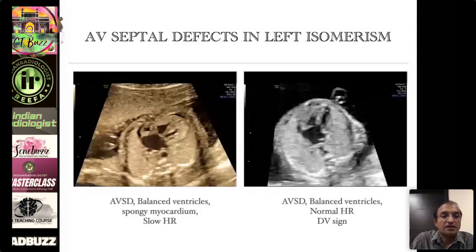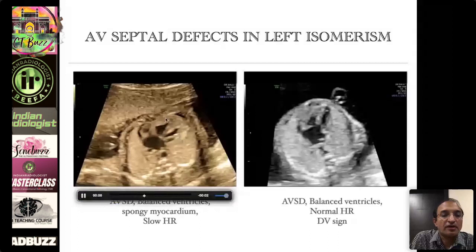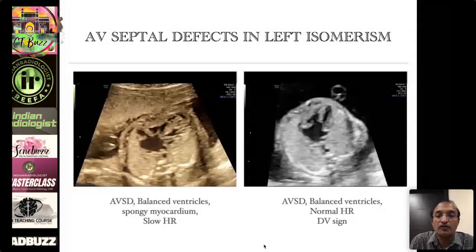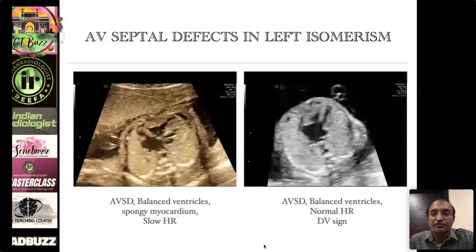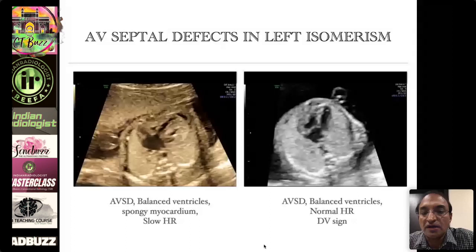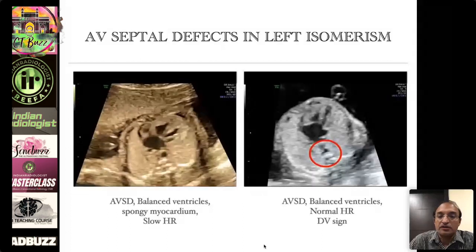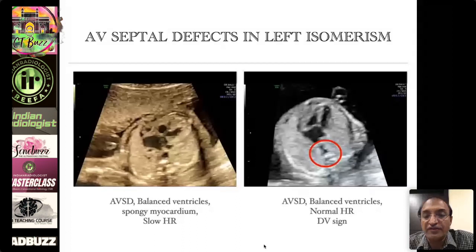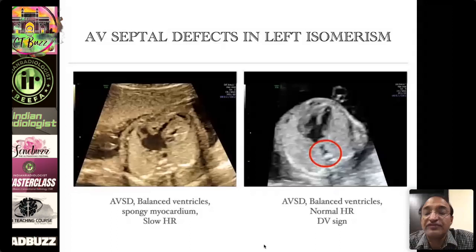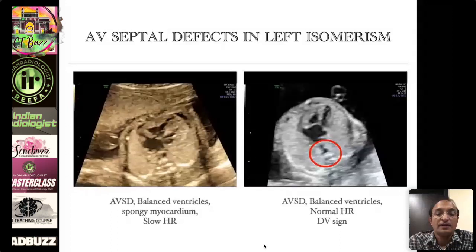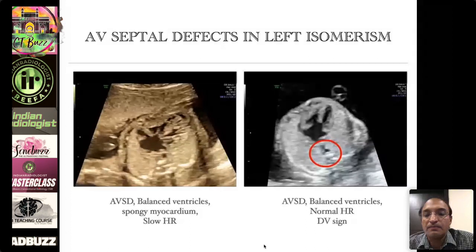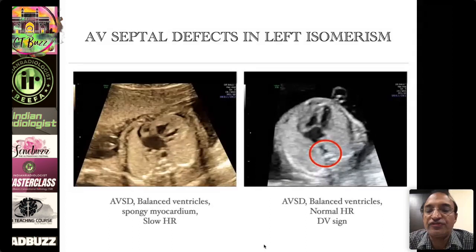This is another type of AV septal defect — you see two good-sized ventricles, but notice how slow the heart rate is. This is typically the type found in left isomerism, often associated with complete heart block. On the other image you see a very interesting finding: two vessels instead of one where the descending aorta is — this is called the double vessel sign. One is the aorta and the second is a dilated azygos vein, because the inferior vena cava is interrupted. This is the hallmark of left isomerism, and the double vessel sign immediately points you to a diagnosis of left isomerism or heterotaxy.